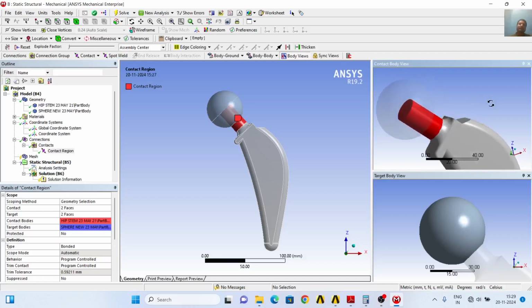So how will you calculate this contact area? You will first calculate the area. You will use the formula pi r squared, where r is the radius of the upper part of the body.